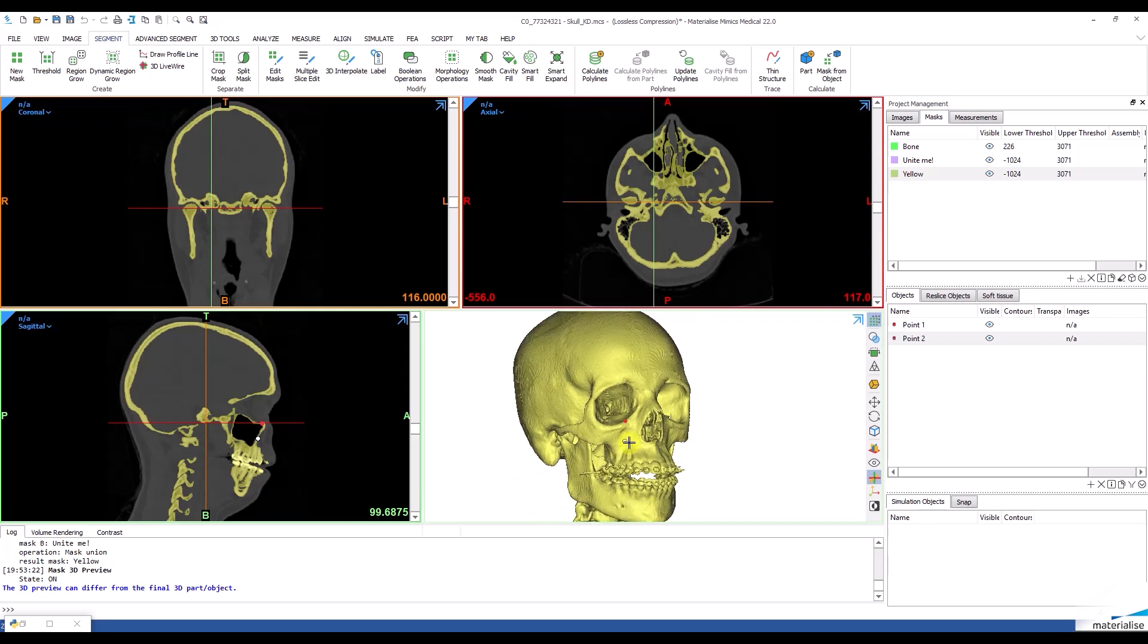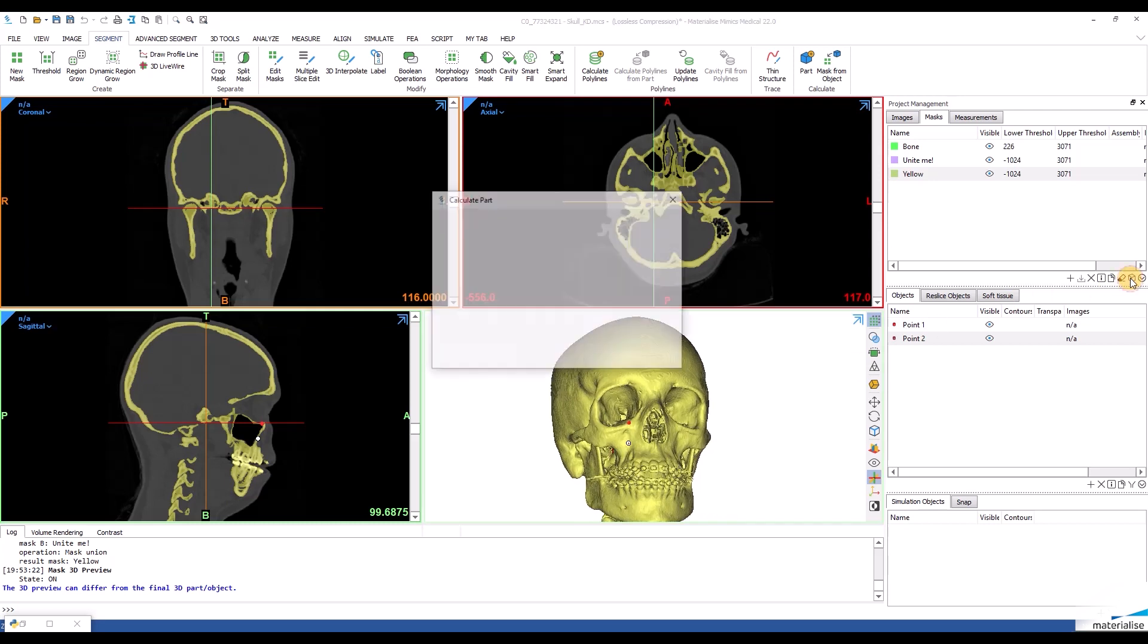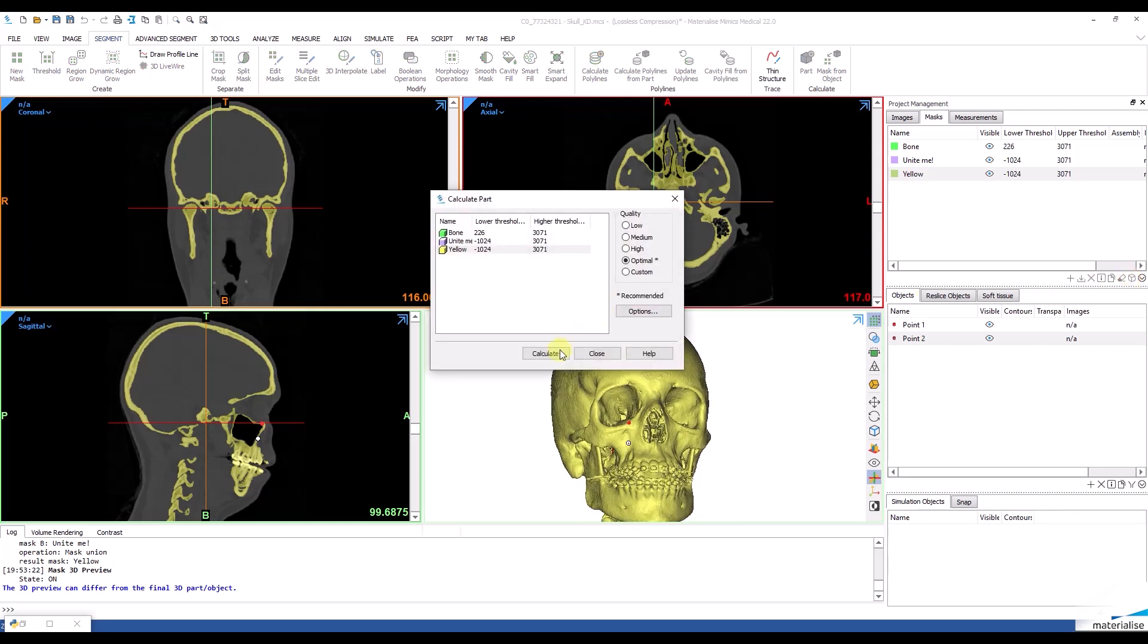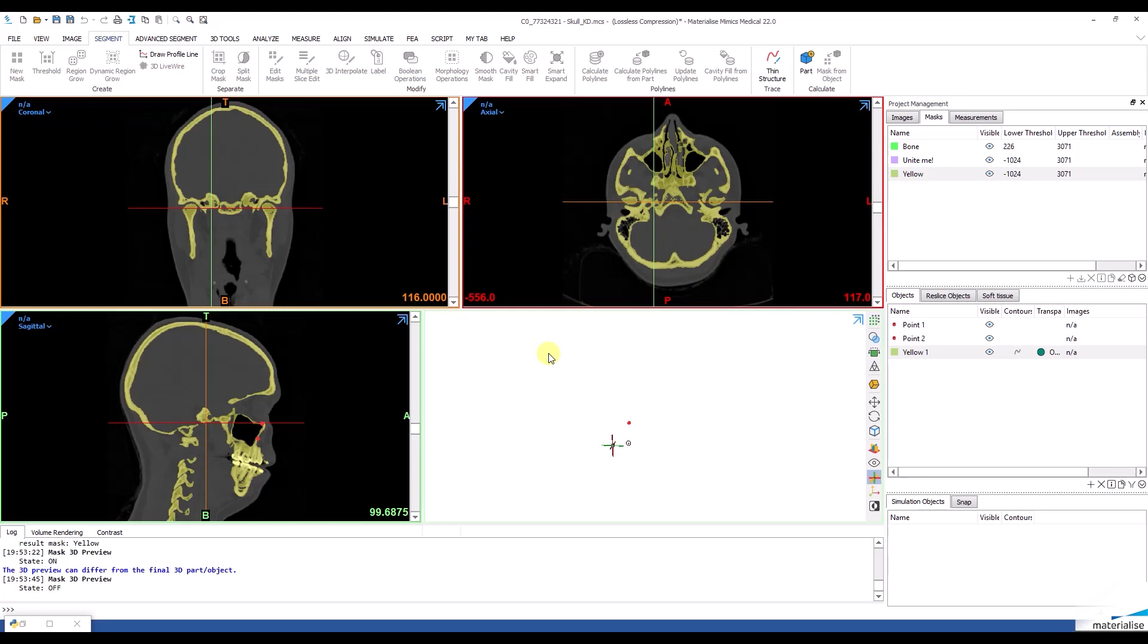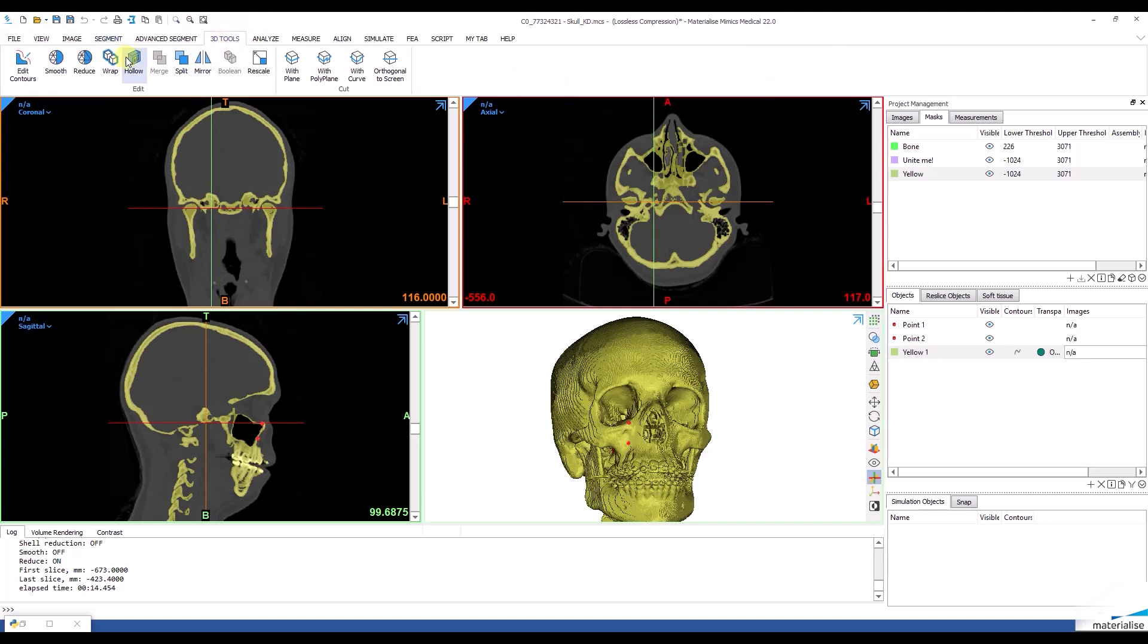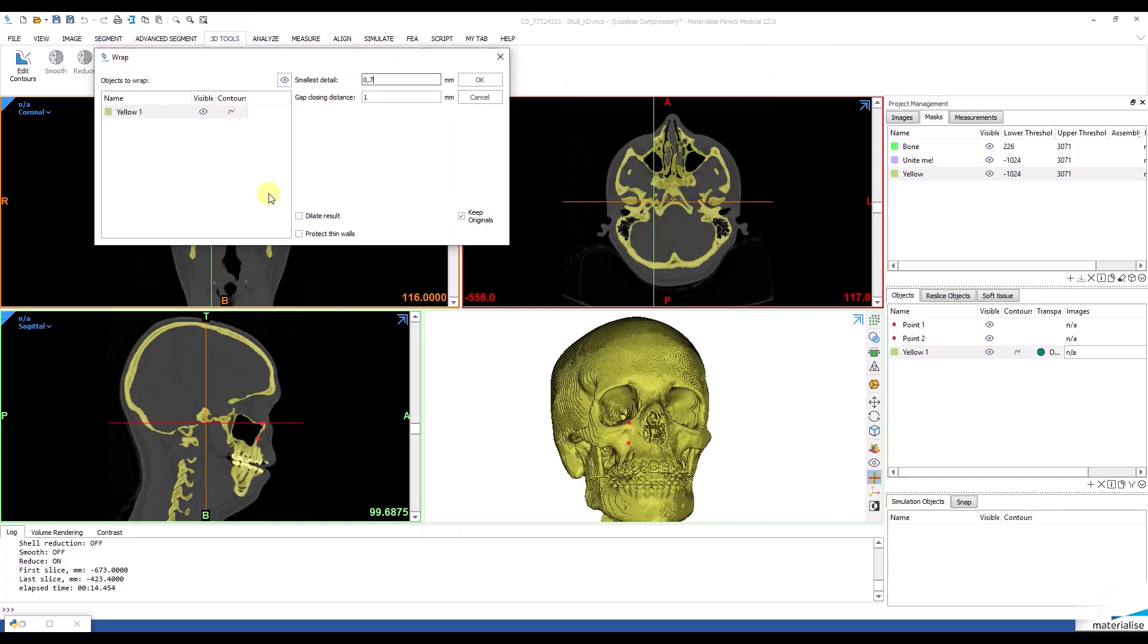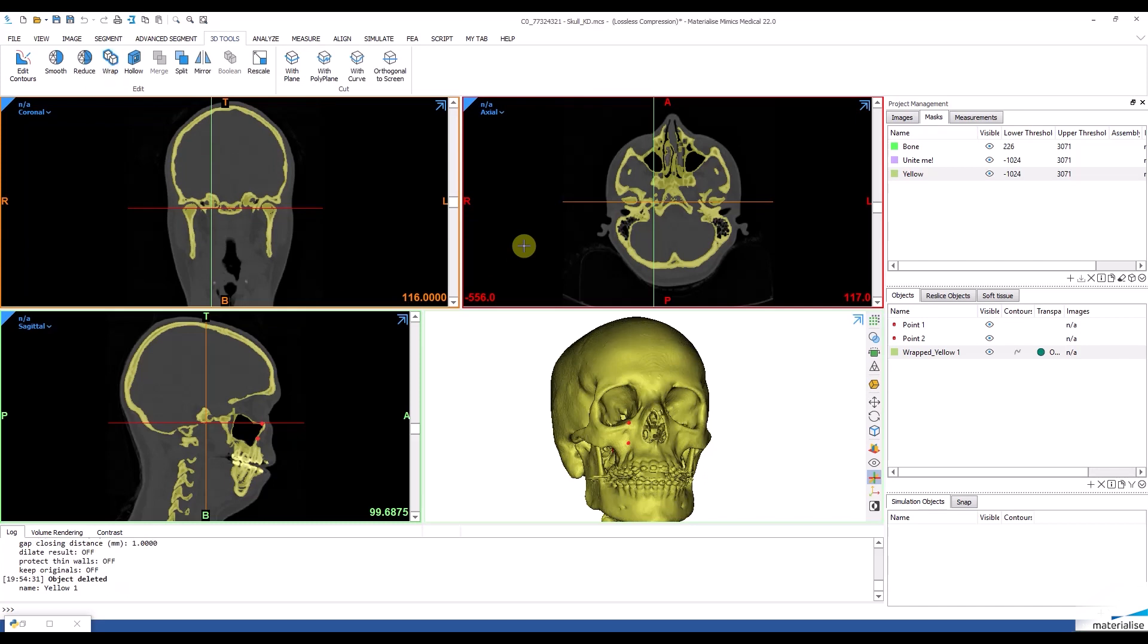Now we can make some small adjustments such as removing the scatter or the spine and then actually create our 3D model. I can now wrap my part to make the surface smoother and give it a bony color.